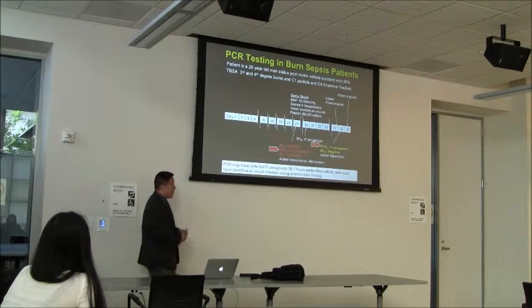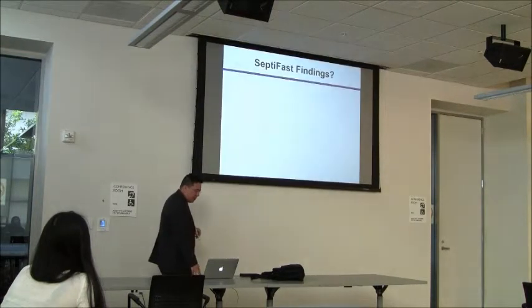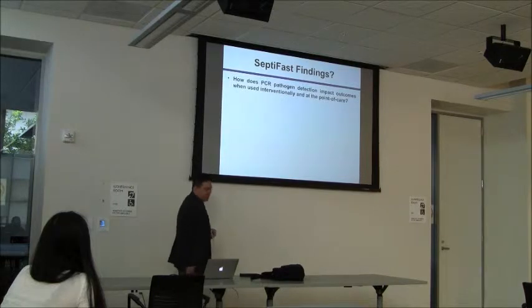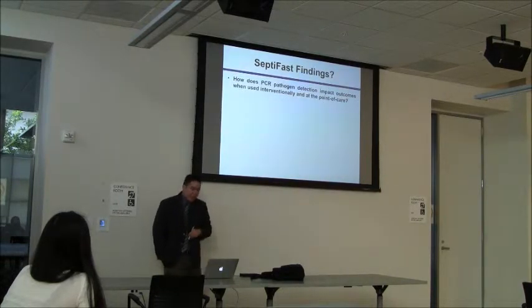So it's possible that this patient continued to have an infection that culture could not detect. So here we are. This was about 2008. And we have a couple questions. First being, how does PCR pathogen detection impact outcomes?